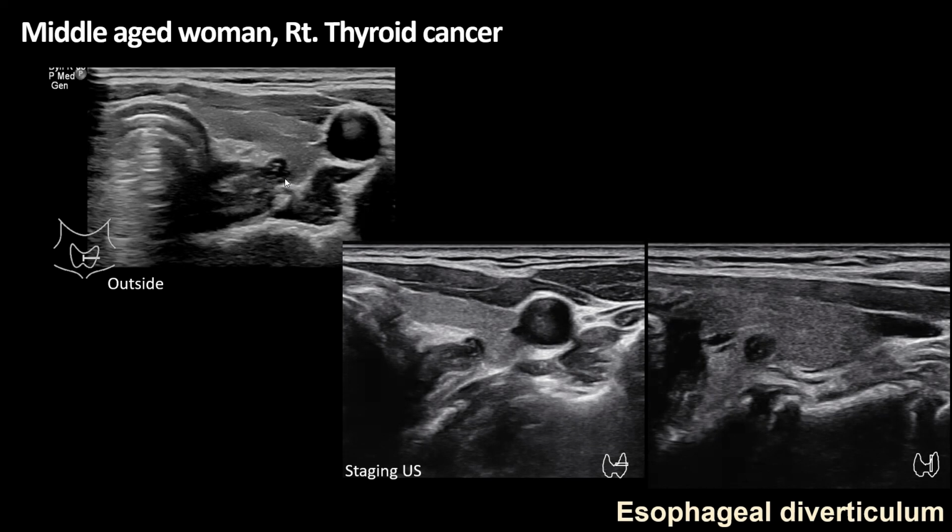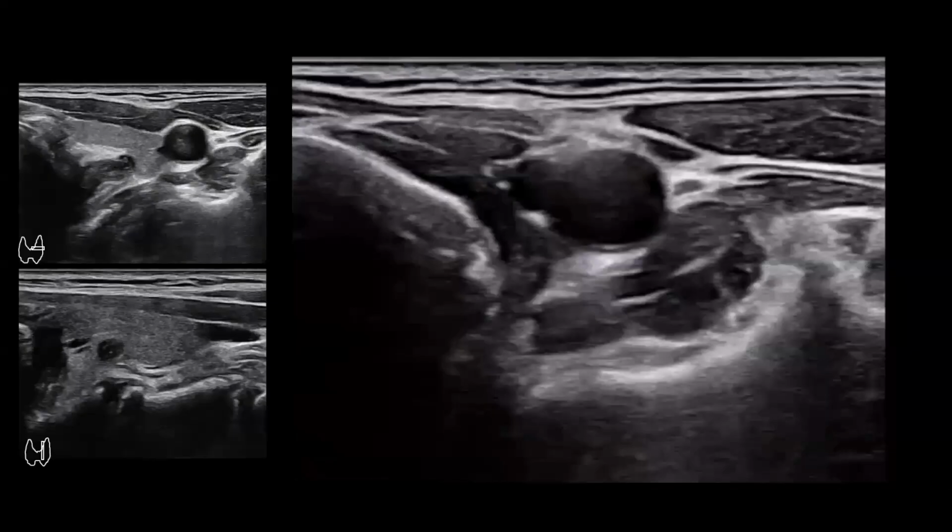In the transverse scan of ultrasound, a connection to the esophagus is seen behind a small hypoechoic nodule right in front of the esophagus. And in the longitudinal scan, it looks like a lump inside the thyroid gland. Since the nodule is a three-dimensional form, it is common for the position to look different depending on the angle. I'll show you an ultrasound video.